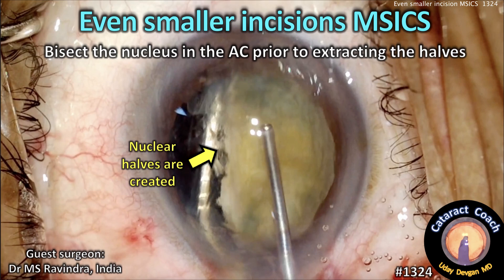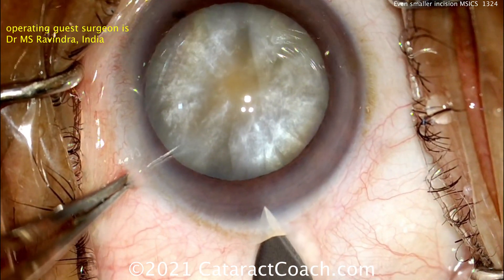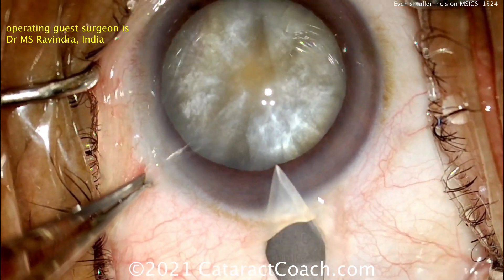CataractCoach.com. Even smaller incisions for MSICS. Here's a technique where you can bisect the nucleus in the AC prior to extracting the halves. Our operating guest surgeon here is Dr. M.S. Ravindra from India.